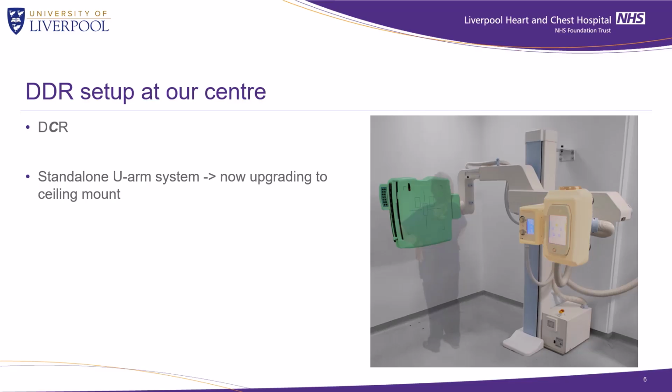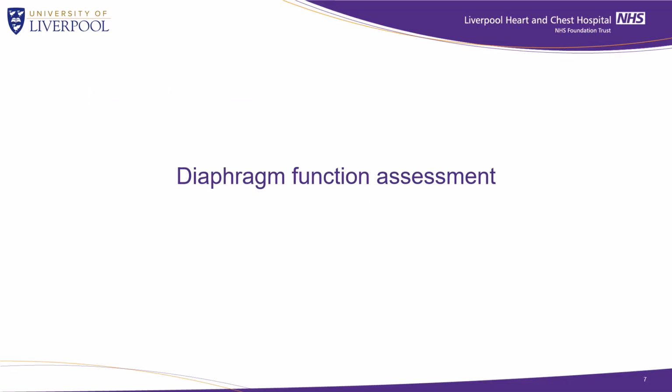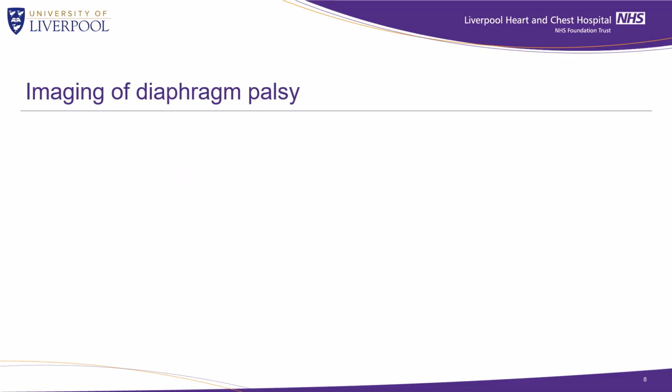We found the entire process of image setup, acquisition, and PACS transfer takes around 5 minutes per exam. We do have a recorded voice protocol for breathing instructions, though most exams are directed by a radiographer. The exposure settings that we use are similar to those of other centres and other clinical studies using DCR. First, let's go into diaphragm function assessment.